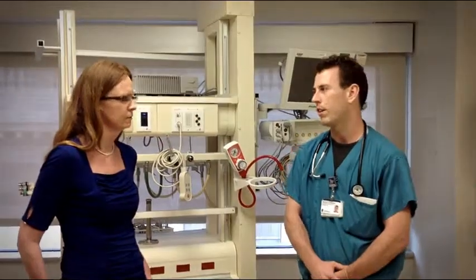And there's different levels of pressure support from real low to high. We just try to make sure the patient's comfortable and synchronous with the ventilator.